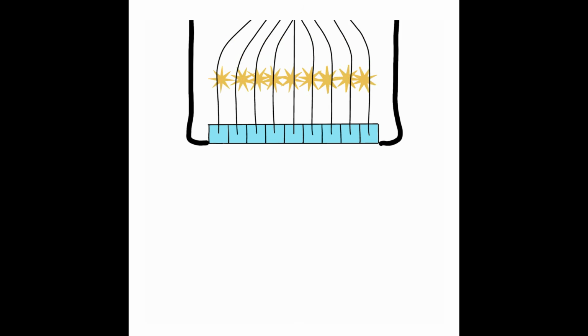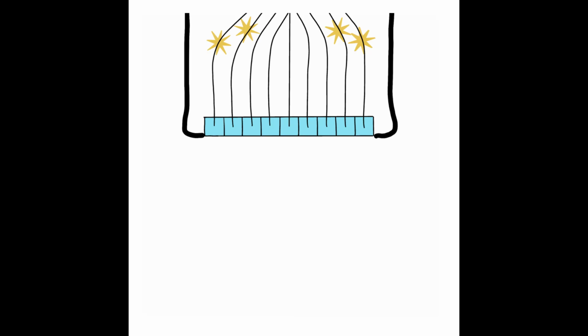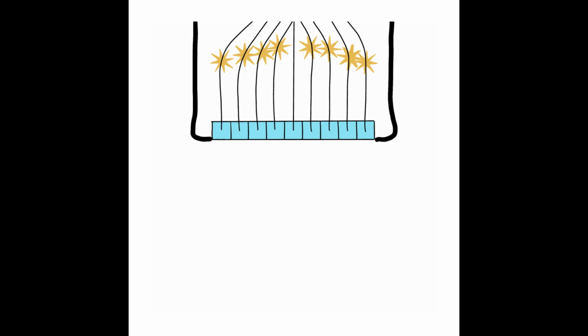So again, when we have the electrical pattern coming down, activating all crystals at the same time, there's no curve, we are going to get a beam that is unfocused. When we introduce a very steep curve, we're going to activate those outer crystals first. The little wavelets are going to come out, they're going to interfere with one another and create a shallow focus. When we see a flatter curve, those elements are going to be activated first on the outside, but a little bit quicker as we move to the middle, and that is going to create a deep focus.